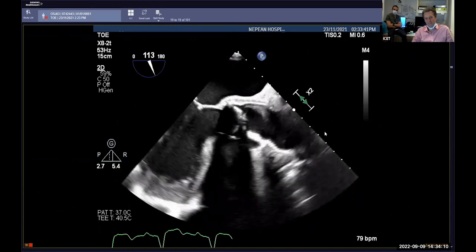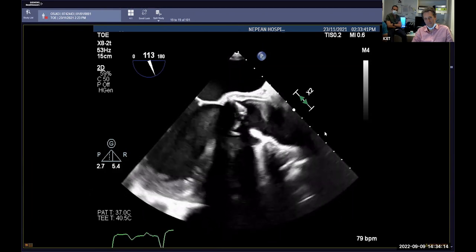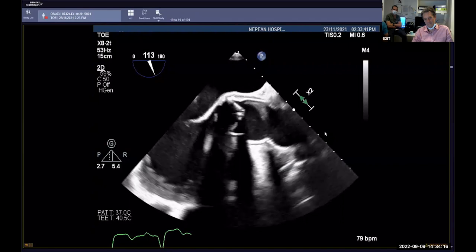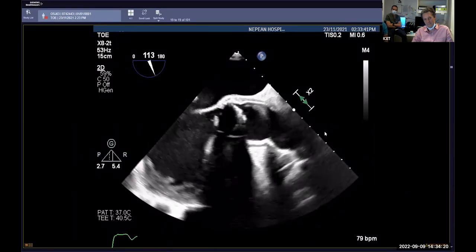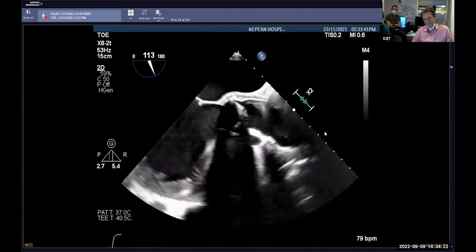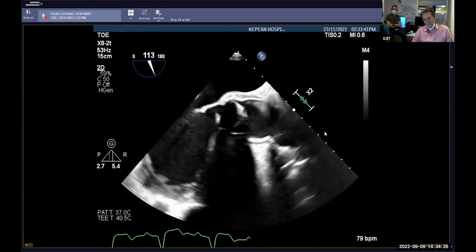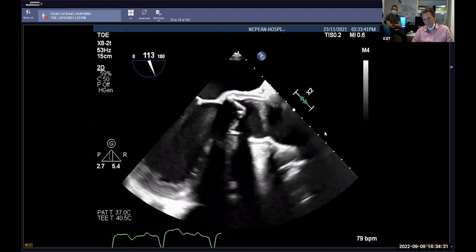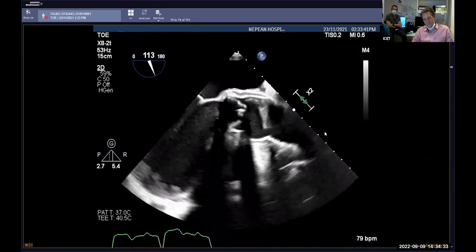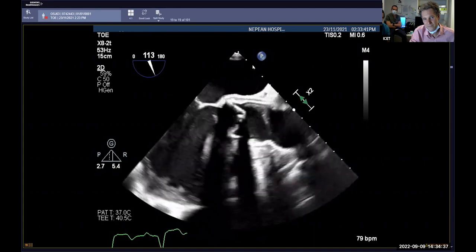All right, so this is the esophageal 3-chamber or a long axis view. Again, we can see that really concerning area of dehiscence there. Again, marked thickening in that region of the hypoechoic region in the aortic wall, which again is concerning. Appears to be some, yeah.